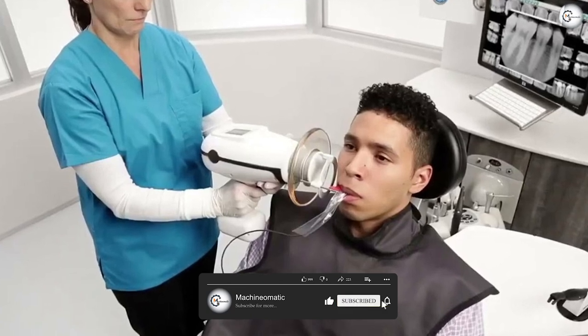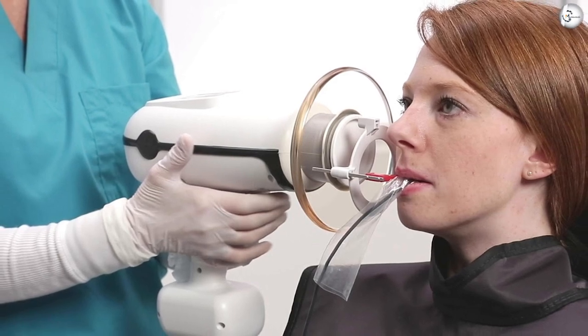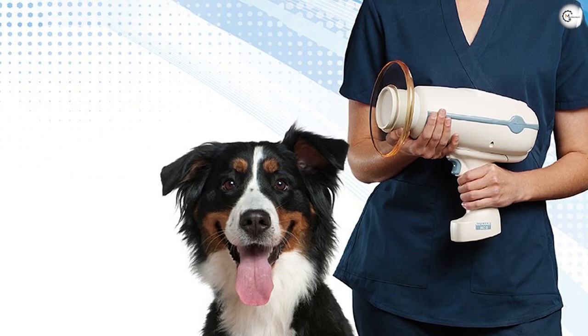Nomad Pro 2 utilizes the latest in X-ray technology: a 0.4 mm focal spot plus a 60-kilovolt DC X-ray generator that consistently delivers exacting, repeatable exposures.